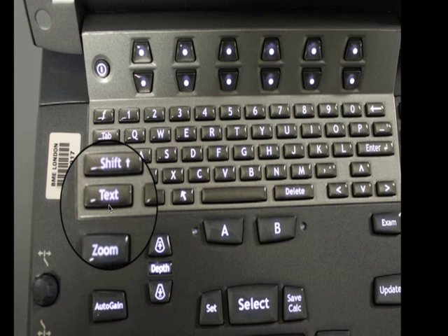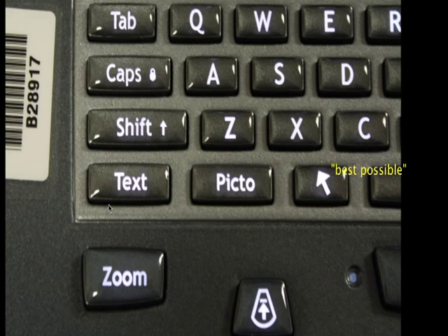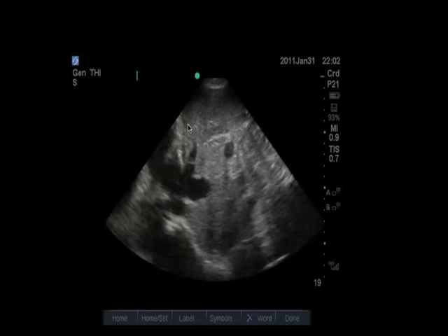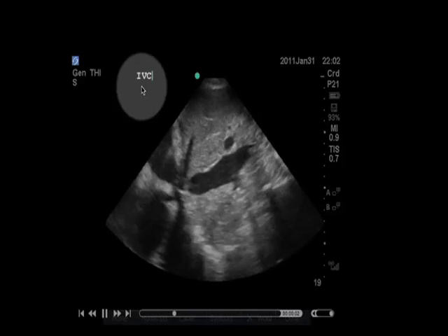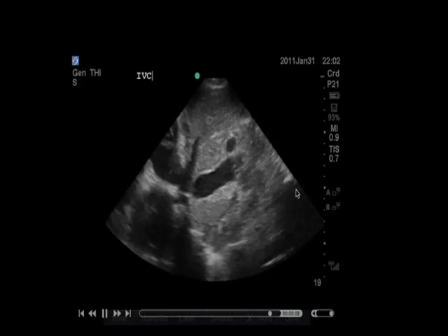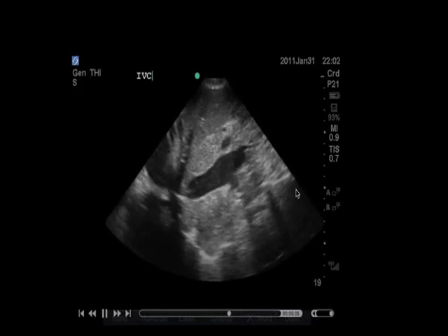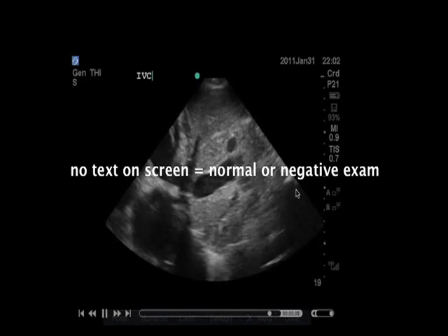There's a text button at the bottom left of the keyboard. Press it at any time, and that will mobilize a cursor on the screen display. You can then type freely anything to do with the findings, such as 'positive for free fluid,' 'indeterminate,' 'best exam possible,' or any other descriptors — such as mechanism of injury — that are relevant to the exam. Because the bulk of our scans are normal findings and negative exams, the default presumption is that if you did not type anything on the screen, the exam is considered negative.